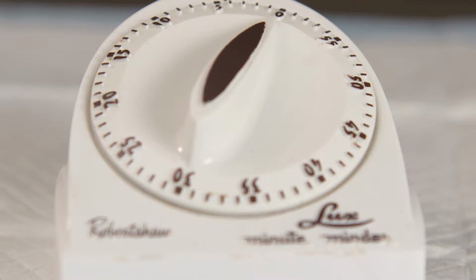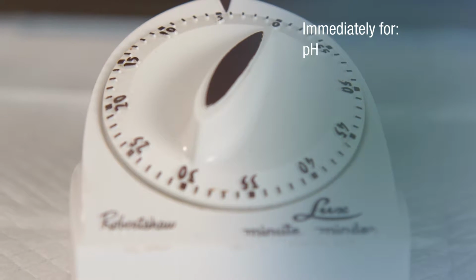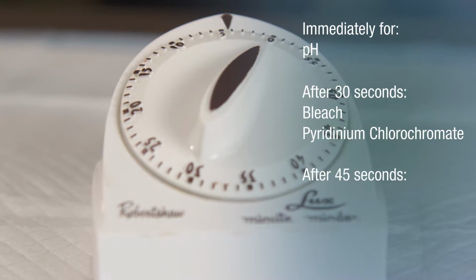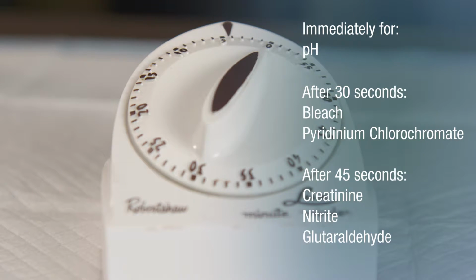Read each test at the specified time after dipping: immediate for pH, 30 seconds for bleach and pyridinium chlorochromate, 45 seconds for creatinine, nitrite, glutaraldehyde, and specific gravity.